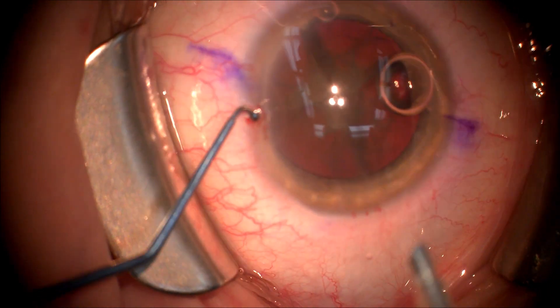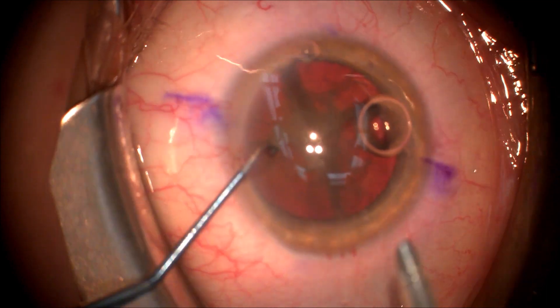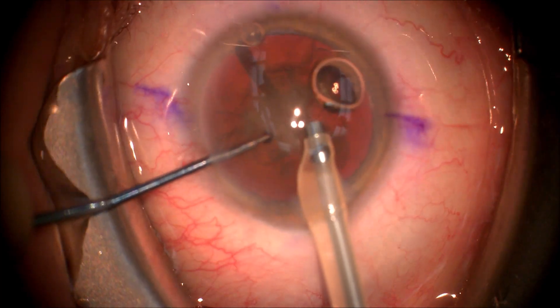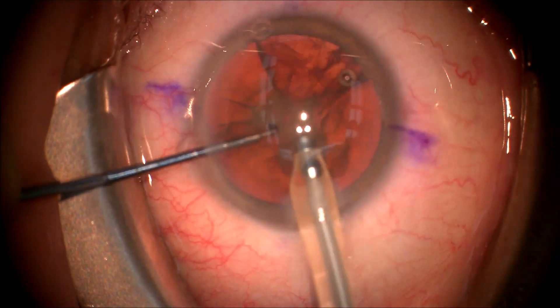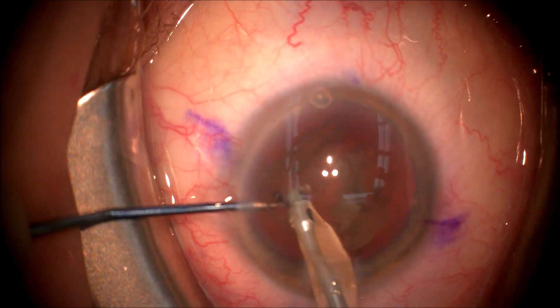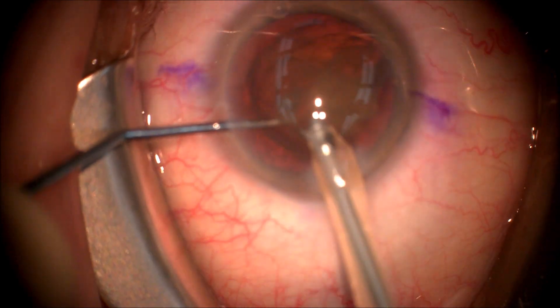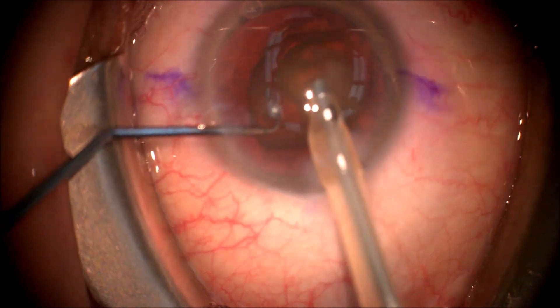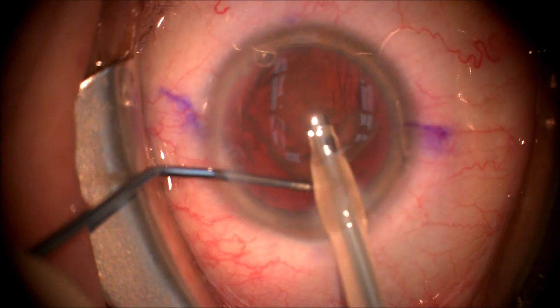We use a Seibel or Connor wand as our second instrument and we're using the Stellaris phacoemulsification unit to remove the cataract. It's set for quadrant removal, and as you can see the first quarter of the cataract comes out very quickly. We emulsify it through our handpiece, which breaks it up into many little pieces that are sucked out through the middle part of the phacoemulsification handpiece, which is like a straw. Fluid is poured into the eye through the outer sleeve.